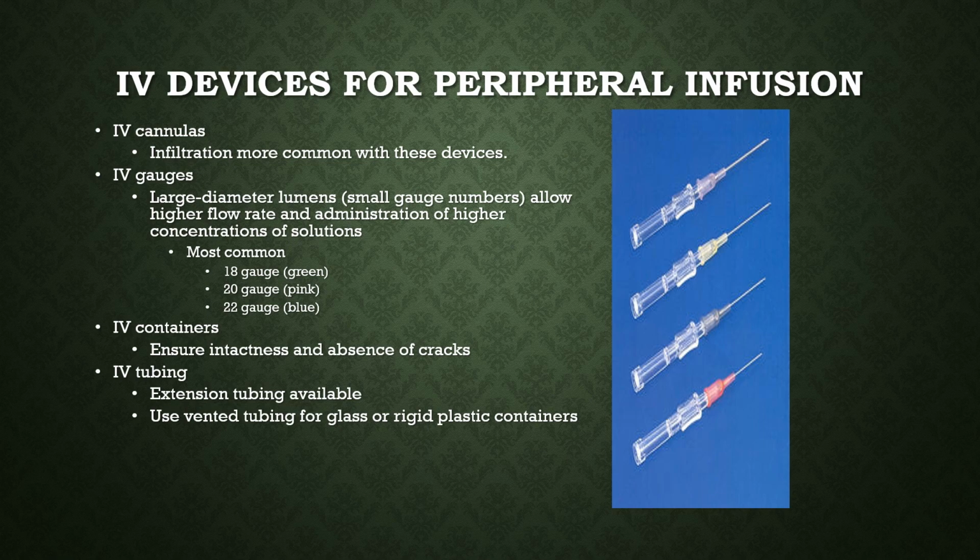And you might see that on an ambulance. If you're donating blood, they might use a 16. In the hospital, for a patient who's hemorrhaging, we like to have an 18. In OB, where I did a lot of my practice, our preference was always get an 18 in. And if we couldn't, anesthesia would be kind of unhappy with us. So we always try to get an 18. And then the smallest size you can use to still give blood: if you want to give blood, you have to have at least a 20 gauge.